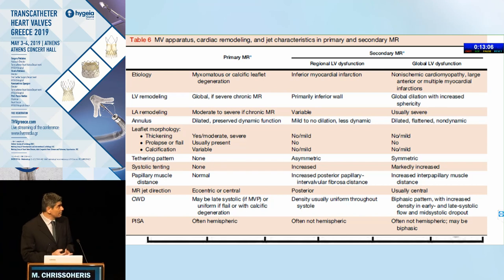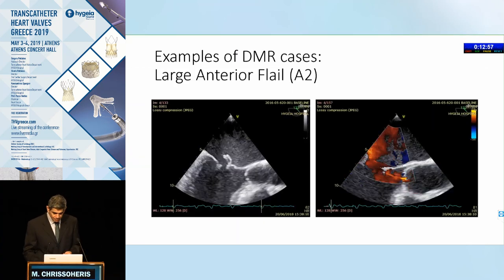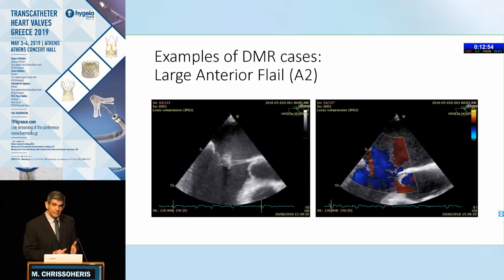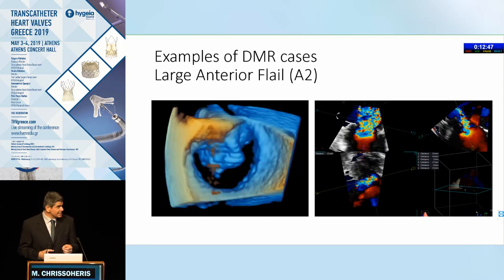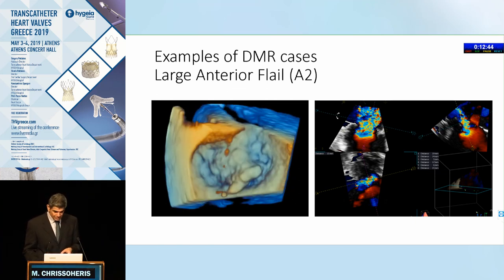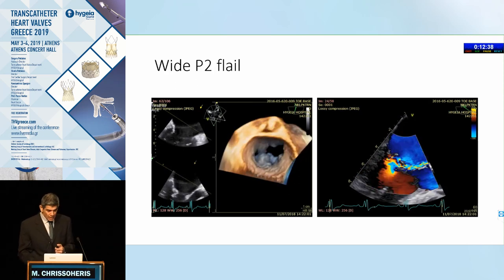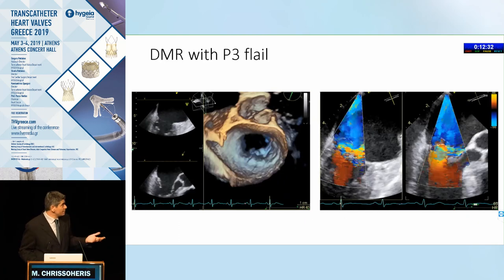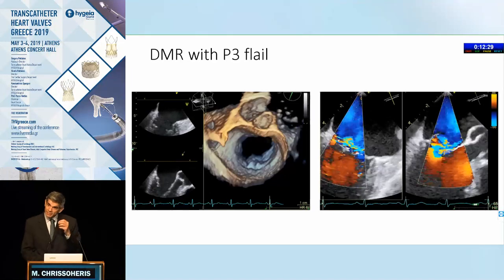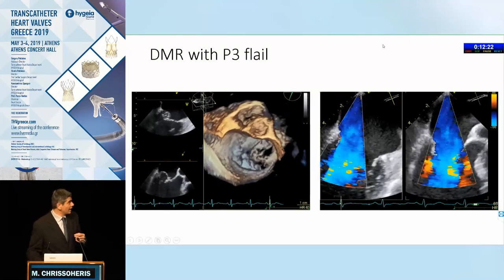When looking at primary and secondary MR, there are multiple areas we could examine regarding the mitral valve apparatus, cardiac remodeling, and associated characteristics. But nothing beats three-dimensional echocardiography in assessing and understanding the problem of the mitral valve — whether a large anterior flail, a complex P2 flail with ruptured cords, a more simple localized P2 flail, or a P3 flail. These images are very crisp and easy to understand for surgeons, interventional cardiologists, and everybody to be on the same page.